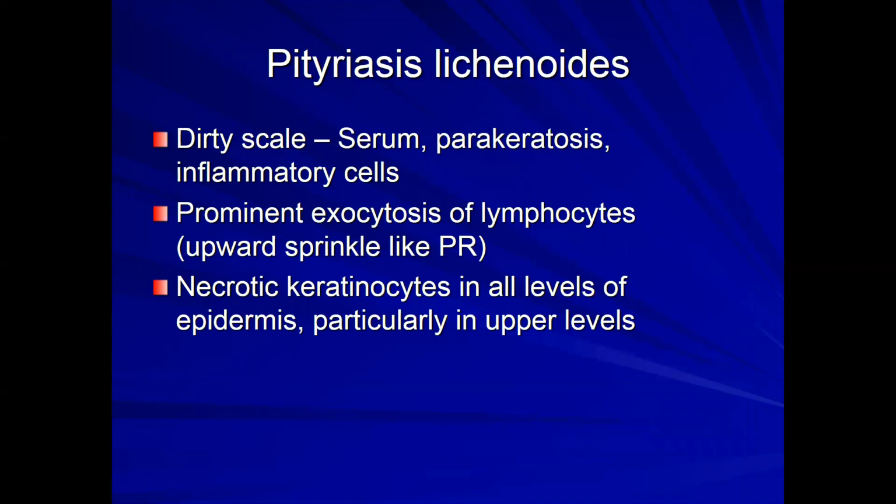Pityriasis lichenoides. So I mentioned in the last episode that the word pityriasis tends to refer to entities where you have a lot of exocytosis of lymphocytes. So pityriasis lichenoides, like pityriasis rosea, has a lot of exocytosis of lymphocytes. I can't tell you how many times I've gone over slides with residents and they want to make the diagnosis on extravasated erythrocytes, but so many things have extravasated erythrocytes. And so many times you have entities like this that don't have extravasated erythrocytes. So I would not use that as your number one feature.